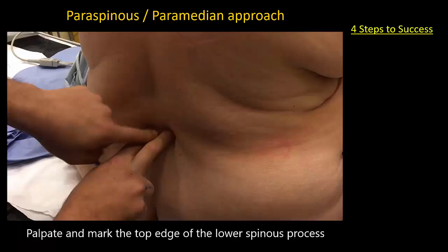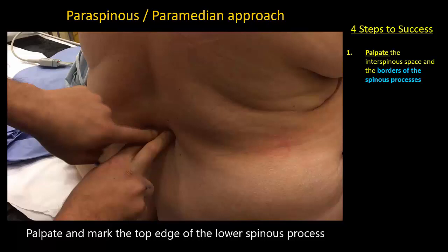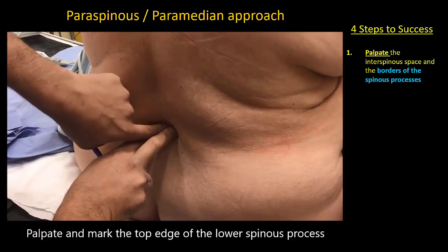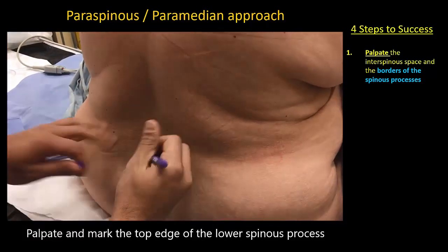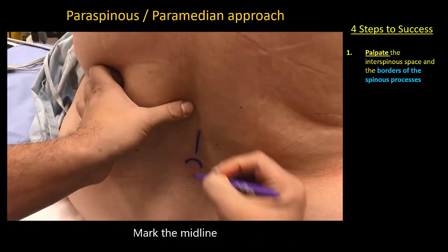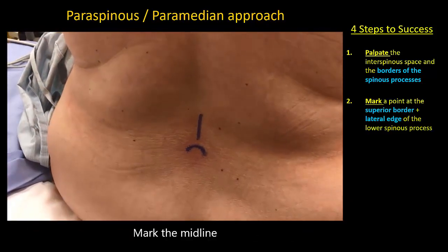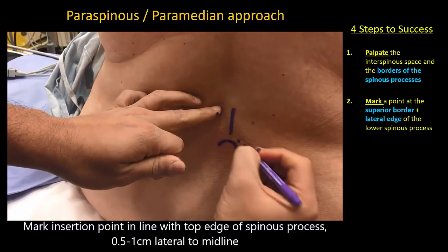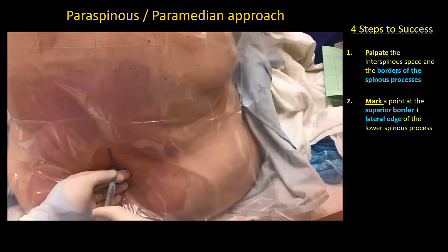There are four simple steps to a successful paraspinous approach, illustrated here in a video of a junior resident performing it for his first time under my instruction. First, palpate the desired interspinous space, but more importantly, establish the superior border of the lower spinous process. Second, mark the needle insertion point at the superior edge of the lower spinous process and adjacent to its lateral edge.